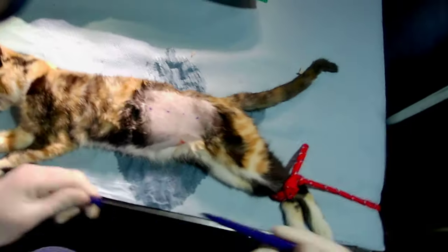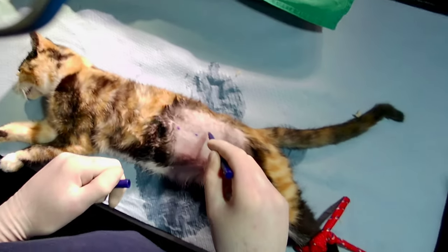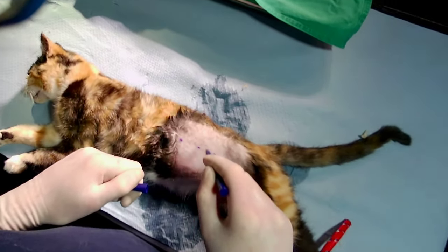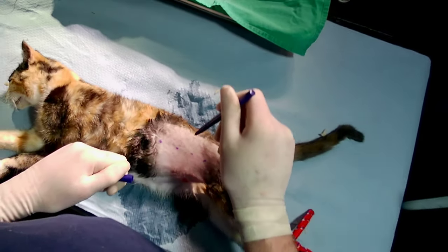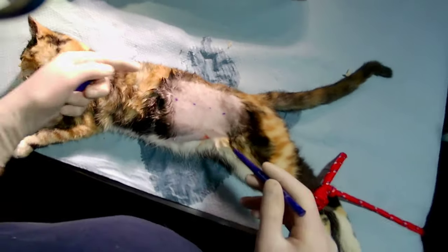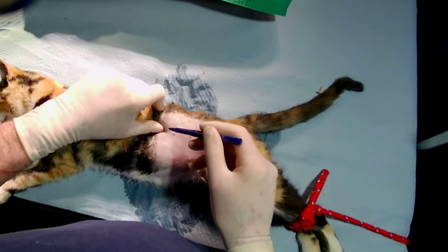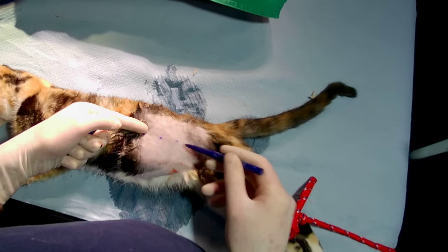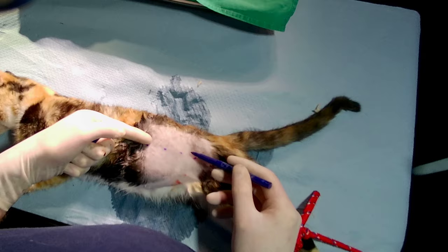For a right flank cat spay, the most important thing is to get the incision correct. If you go too high you can go into the retroperitoneum — it will go through the fat and muscle and you'll end up in the wrong plane. You need to make sure you're going into the abdomen. The lumbar vertebra finishes here; roll your thumb off it and go about a finger below. There's an imaginary line going across — you don't want to go past that because that's where the ureters are.